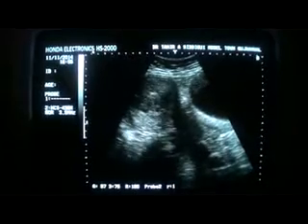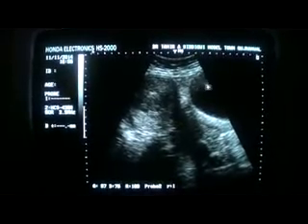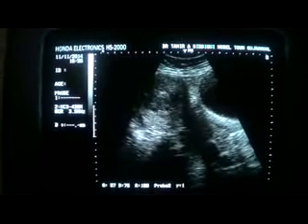This is the longitudinal section of the uterus and this is the urinary bladder, cervix, cervical canal. This is the fundus of the uterus, posterior myometrium, anterior myometrium.